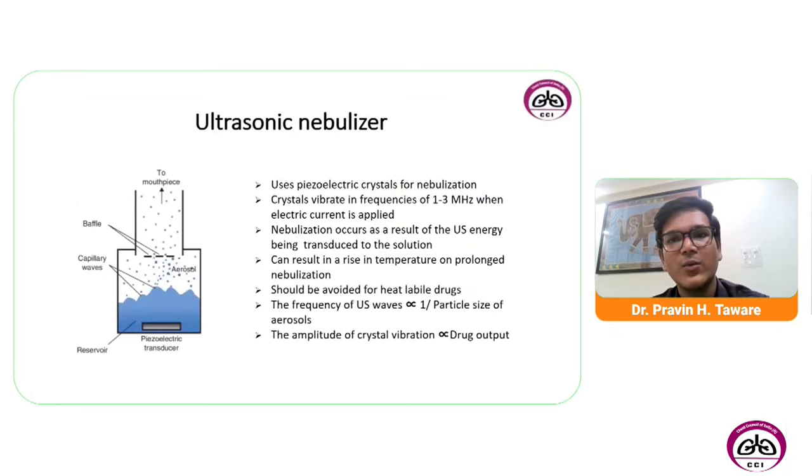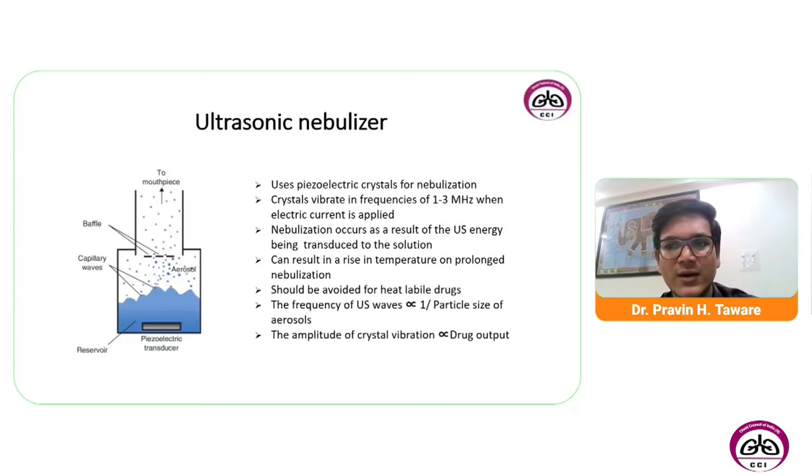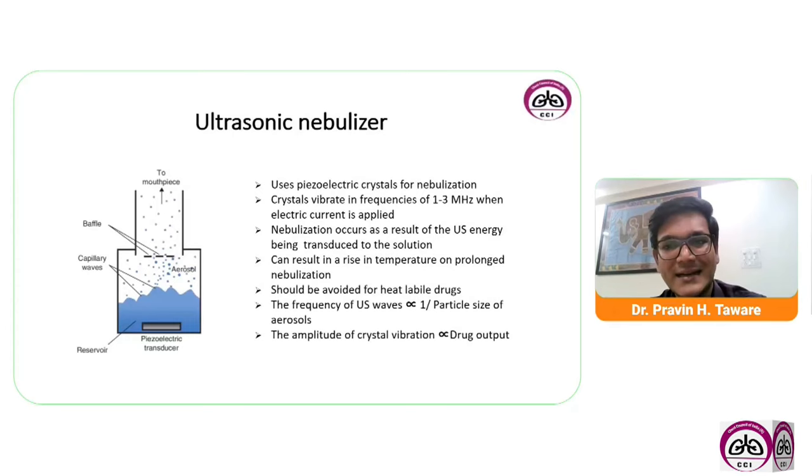What are ultrasonic nebulizers? They use a piezoelectric crystal for nebulization, and the crystal vibrates at a frequency of 1 to 3 megahertz when electric current is passed. Nebulization occurs as a result of ultrasonic energy being transduced to the solution, but it can lead to a rise in temperature and should be avoided for heat-labile drugs.